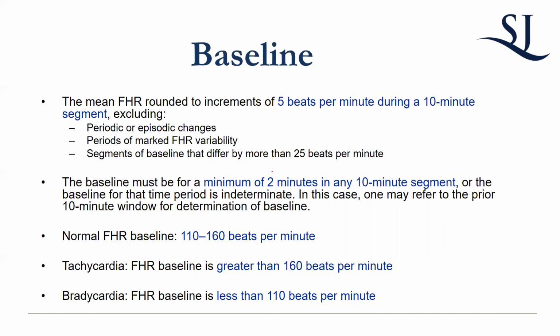What you need to remember is that the normal baseline is 110 to 160, okay? If it's within that range, it's fine. So that's why it kind of doesn't matter if it's 130 or 140 or 150. It's normal, okay? You want to know what a baseline is because if there are changes to that, that's something you want to be aware of, but having a baseline change is acceptable, okay? As long as it's within the normal range.